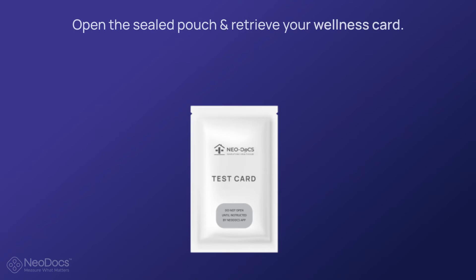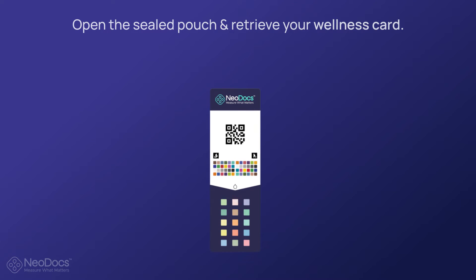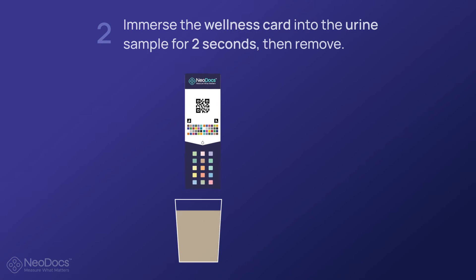Make sure that the container is filled till right under the top. Open the sealed pouch and retrieve your wellness card. It is important you open the wellness card sachet only after collecting your urine sample, since the card is moisture sensitive and at risk of contamination.